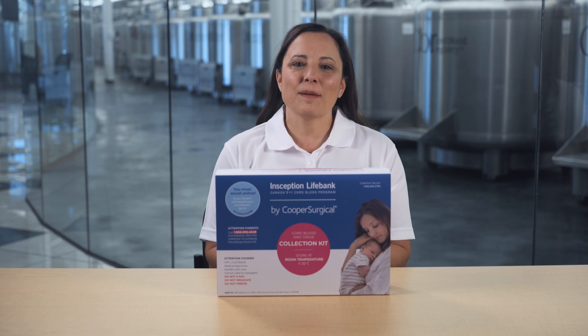Hi, welcome to the Inception Life Bank family. Now that you've enrolled with Inception Life Bank, there are just a few more steps to take.